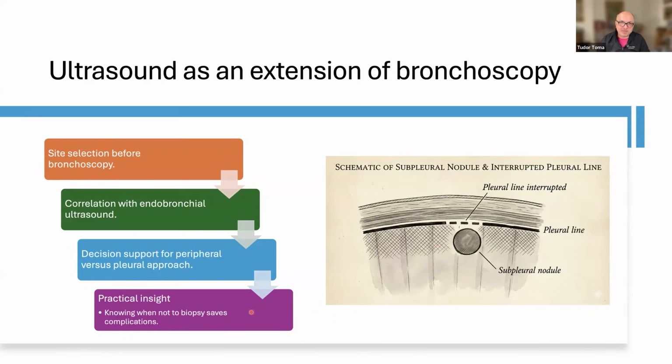And the other main benefit, which is very helpful even for the trainees, is to quickly diagnose a complication related to a transbronchial biopsy or to a peripheral biopsy there and then in the bronchoscopy room, without the need to move the patient to radiology or wait for the radiology to approve an X-ray and so on, to diagnose if the patient has a pneumothorax.